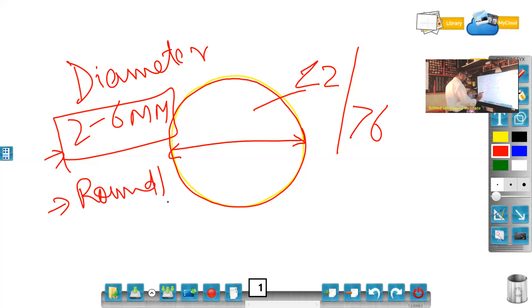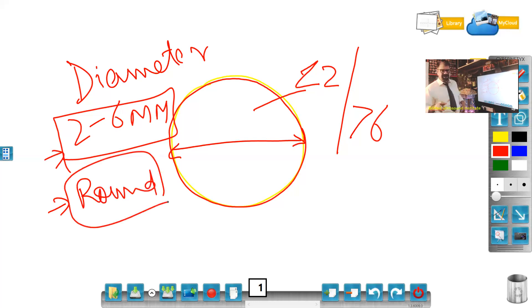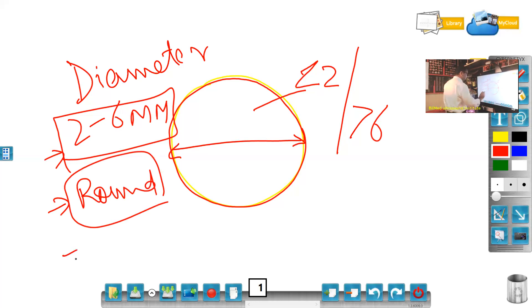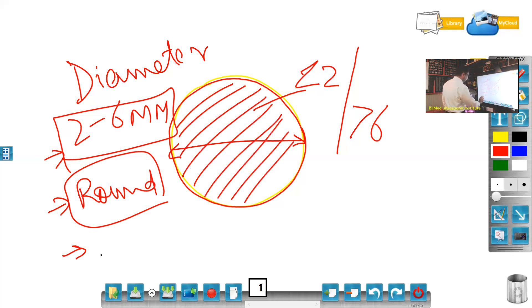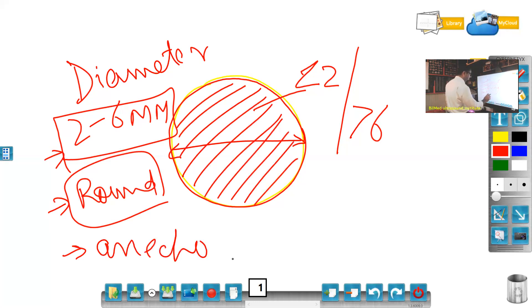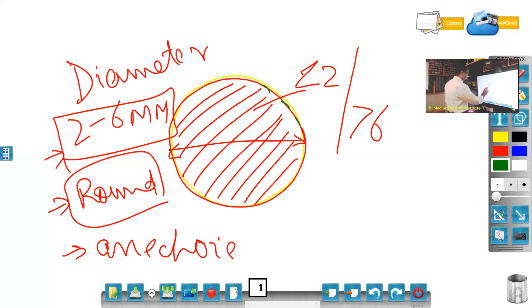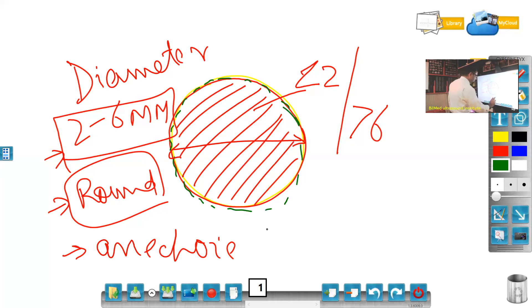No oval, no distorted shape is accepted — only a round shape. Now, the structure itself should be jet black, anechoic. It should be anechoic, and there should be no calcification from the wall — no calcification. That is the fourth point.